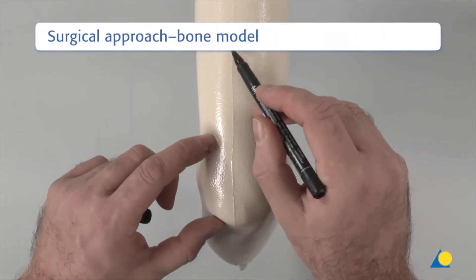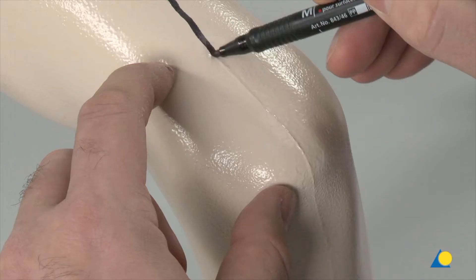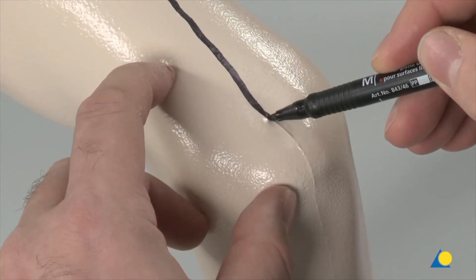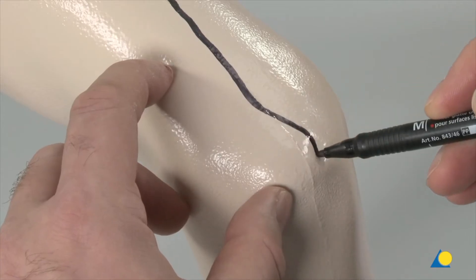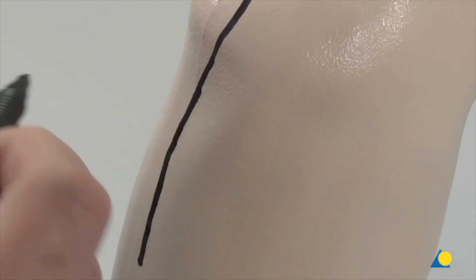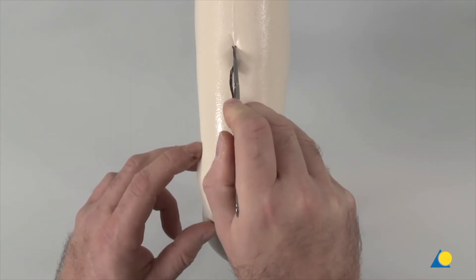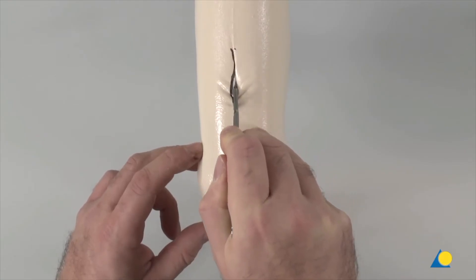The skin incision is marked. Because of the foam, start higher to make a straight incision, then curve around the olecranon and then back down the crest of the ulna. The incision is made down to the fascia of the triceps and down to the ulna.